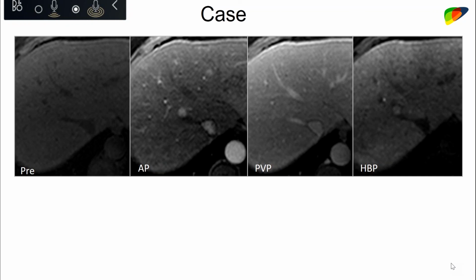And Victoria, I don't know if you're still on, but how would you handle that? Well, according to LI-RADS, first of all, we have to look at other ancillary and major features. You said major features were not there, but make sure that no other ancillary features of malignancy are present. Assuming that is not there, then these nodules fall under the LR-2 distinctive nodule category because they have no ancillary or major features of malignancy. So I generally don't report those as well.